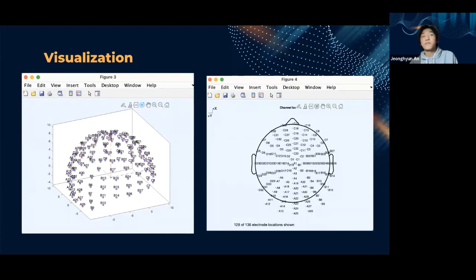As you can see, this image here is not actually unique to our study, as studies that use the same EEG machine would have the same channel locations. But this information is used for drawing spatial significance from the EEG recordings that we have.